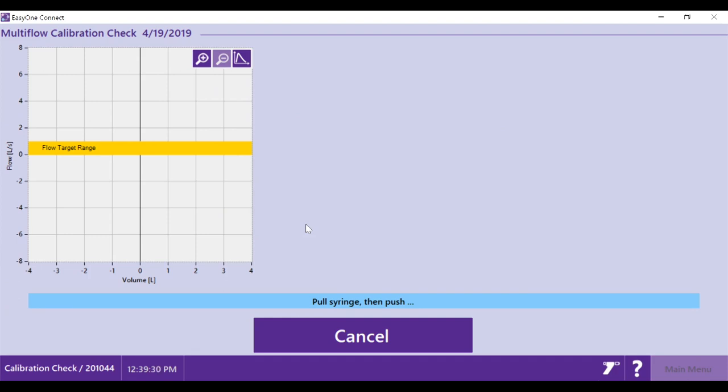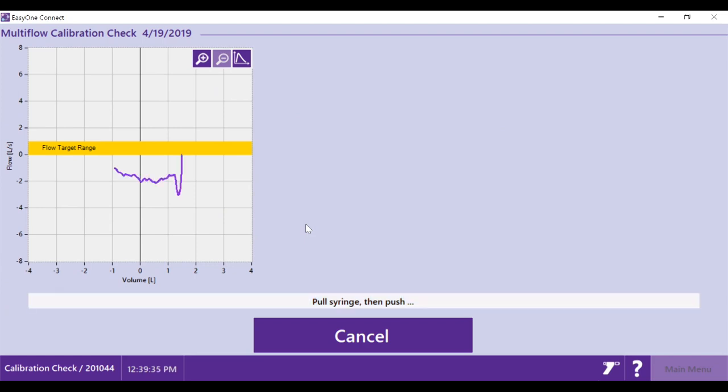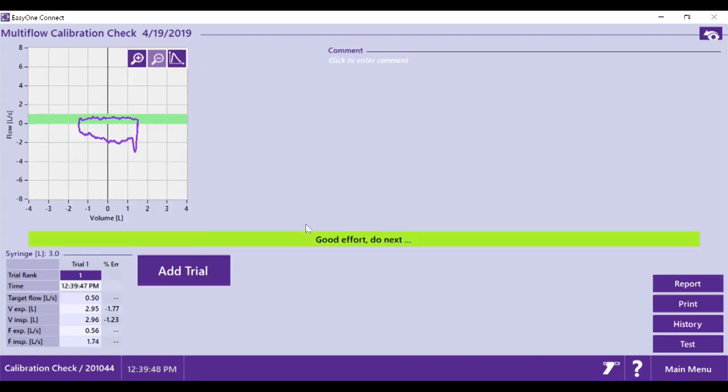The first check will be 6 seconds. To begin, pull the syringe out and push it back in, making sure to stay within that yellow bar. A message will appear, indicating if you've done a good effort, you can move forward. Your graph will appear at the upper left-hand corner, and your values the bottom left. Select Add Trial to move on.